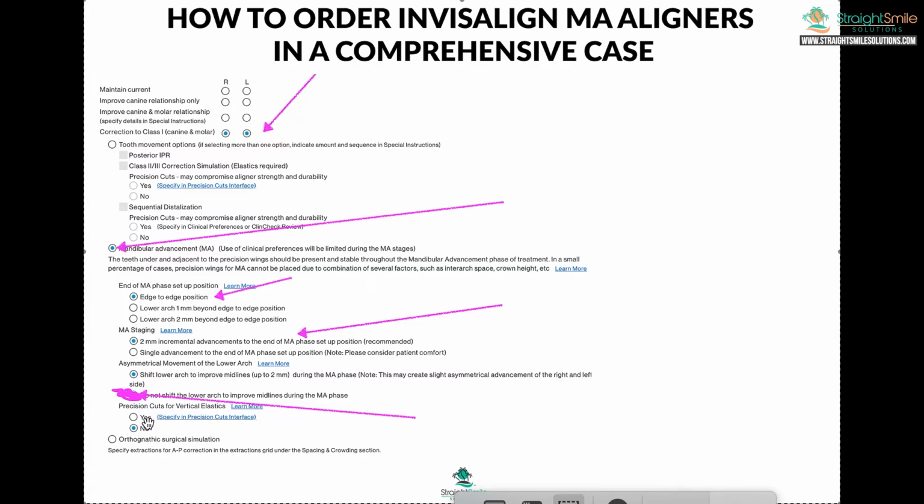If something happens and your case is rejected, there's a bunch of reasons why your case will be rejected. There's a bunch of fine print. Then you need to come up with another way that you're going to fix the overjet, which could be elastics or whatever. But if the patient thinks they're getting growth modification, then you may need to consider first doing something like a bionator, a twin block, an activator, or something like that to stimulate the mandible for 9 to 12 months first, and then scan for Invisalign. However, patients may not like that. So I don't know. I think you just need to be transparent with the parents and let them know that cases aren't always submitted. There's a very tight algorithm.